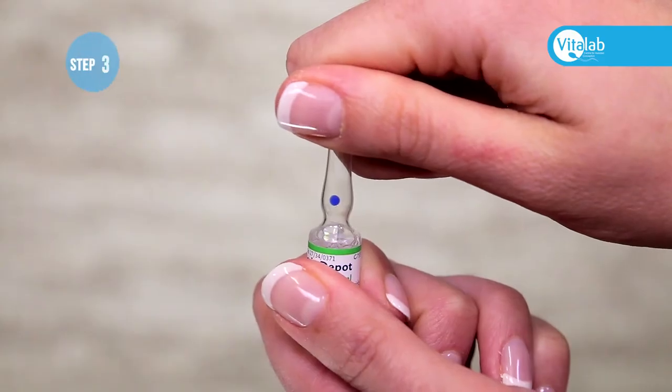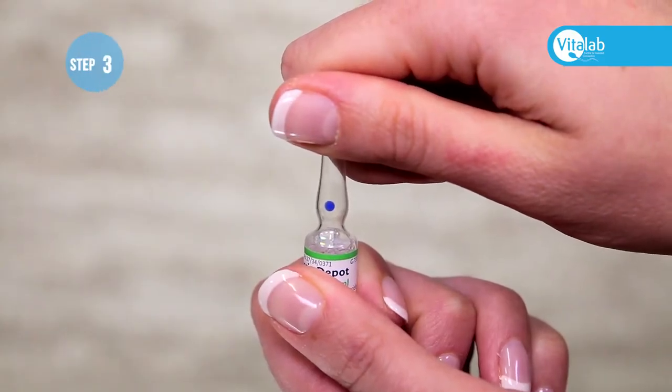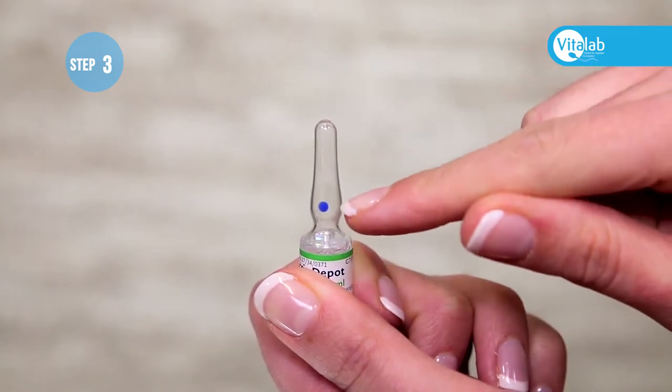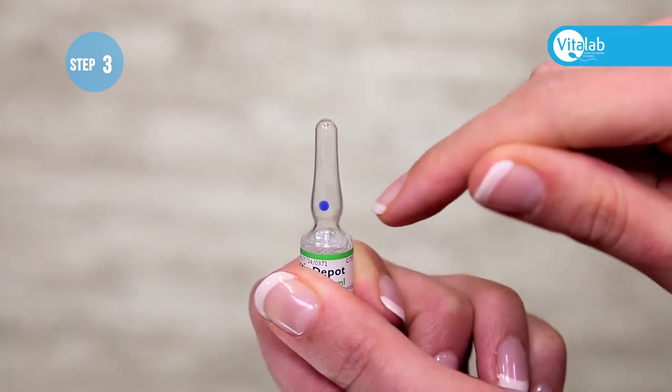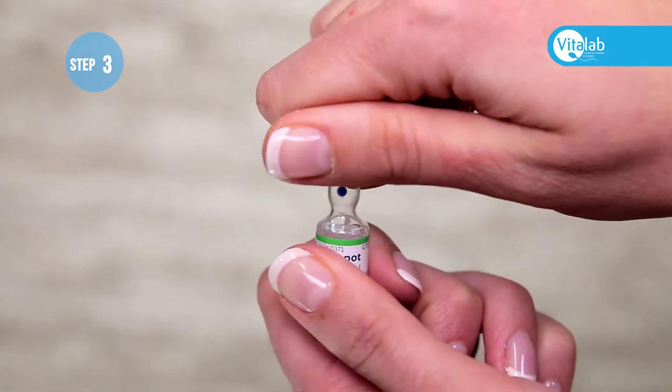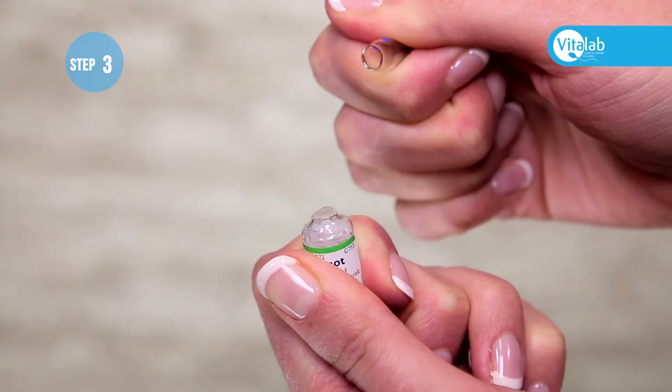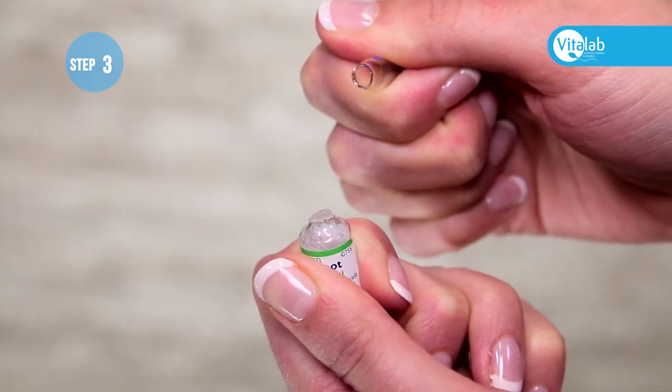Face the blue dot on the ampoule upwards towards the ceiling. If you are right-handed, hold the bottom half of the ampoule in your left hand, hold the top part of the ampoule in your right hand, and snap the top downwards away from the blue dot.